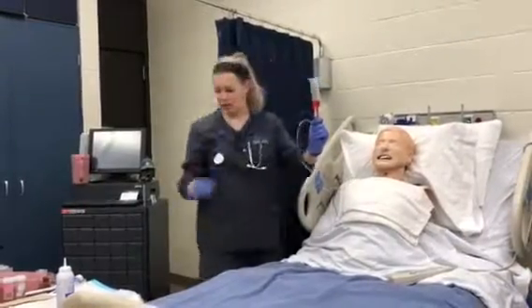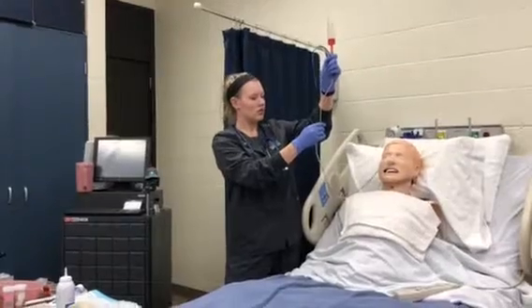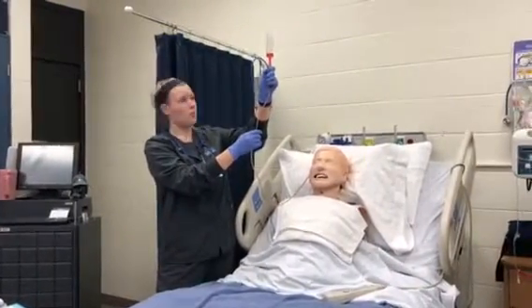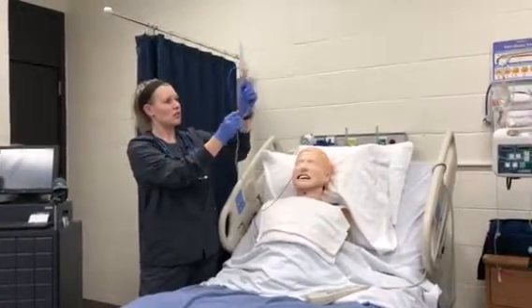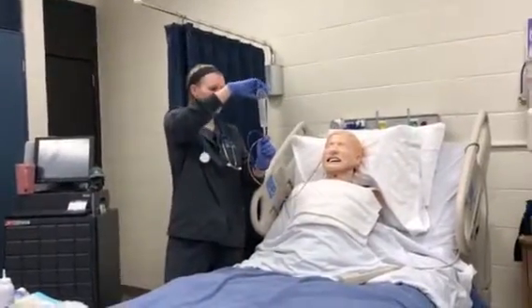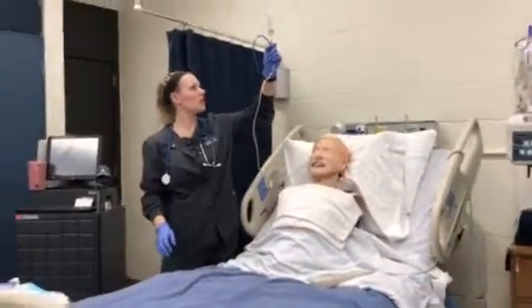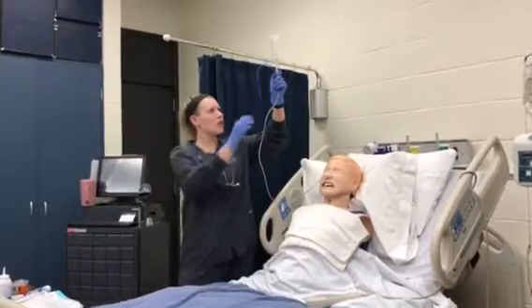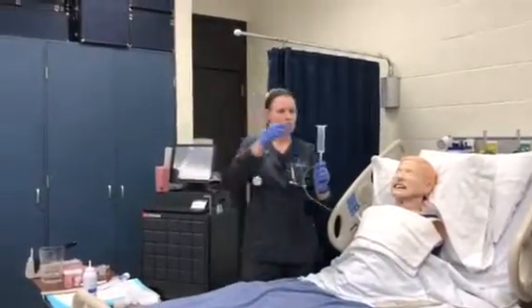And second med. We are going to give 3 meds. Clamp your tubing. Flush. Clamp. Med number 3.